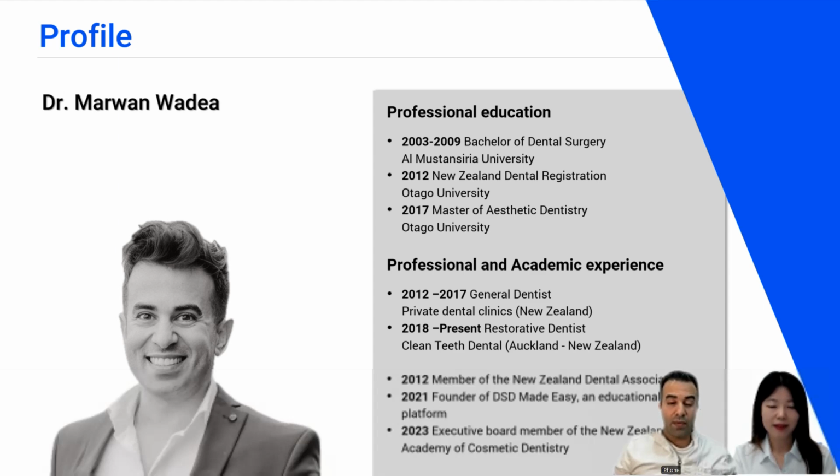What I think is digital, these are tools and so powerful. However, it is for us to understand the theory behind dentistry or cosmetic dentistry or smile design, and then use these tools in order to reach our final goal. And the idea of digital, I always say it's repeatability and scalability and precision and predictability. For these reasons, I'm planning and designing using digital. I used to do it analog. It is possible, but it's not the same.